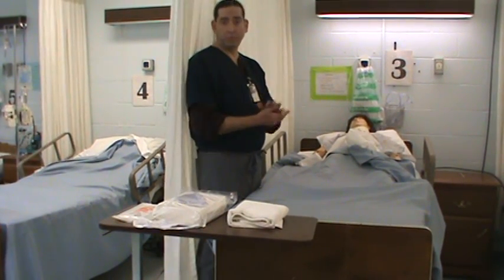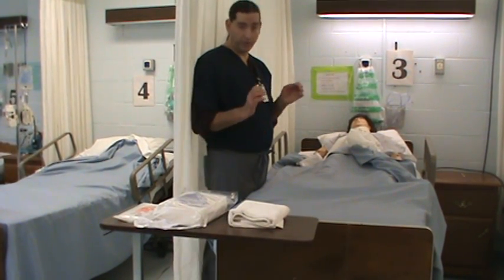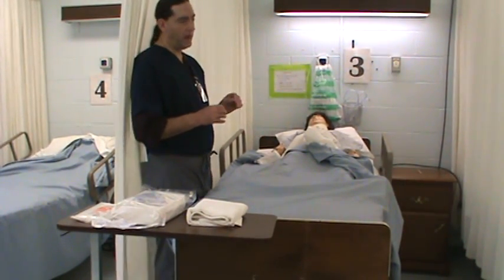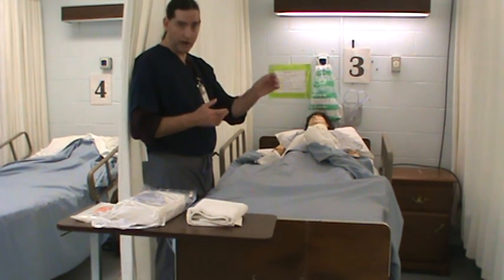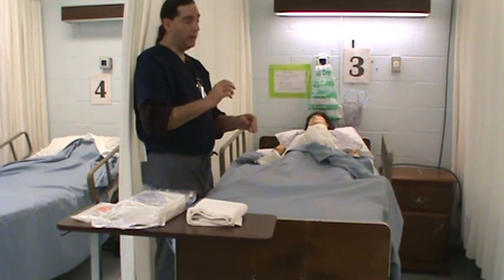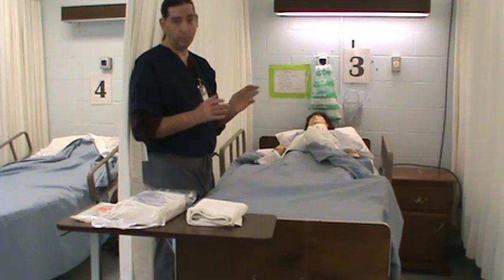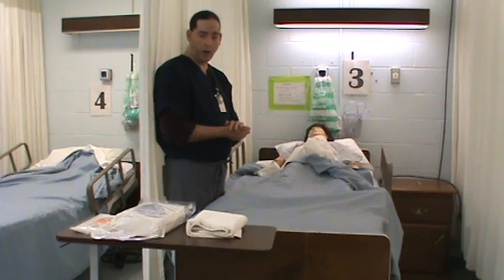We may ask you to explain how you're going to insert a Foley catheter in a male, but it's more difficult inserting a Foley catheter in a female — that's why we're using female gender mannequins. With a male, if they are uncircumcised, you have to retract the foreskin, clean the meatus, and insert your catheter. When you're done, you have to be certain that you replace the foreskin, or there will be big problems a few hours down the line. We are going to place this Foley catheter on this woman patient.